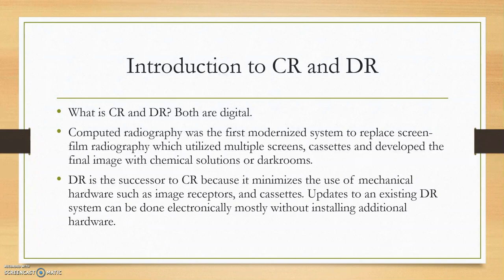Post-processing is basically just after the original radiograph is taken, it can be edited a little bit instead of having to retake it. DR is expensive, but large-scale facilities and hospitals are utilizing them more often. The purpose is to serve the most amount of patients in the least amount of time. It's a cost-effective type of reasoning. The benefits and disadvantages of computed radiography and direct radiography are debated due to the different costs and the necessity of certain features. These will be discussed moving forward.